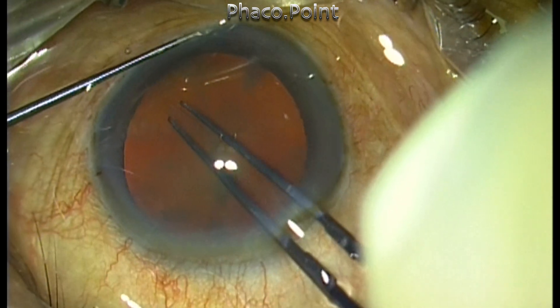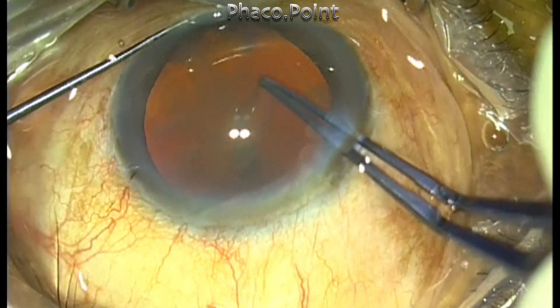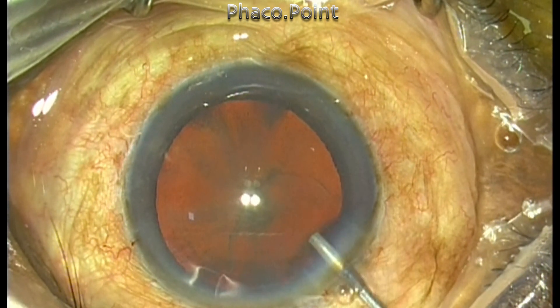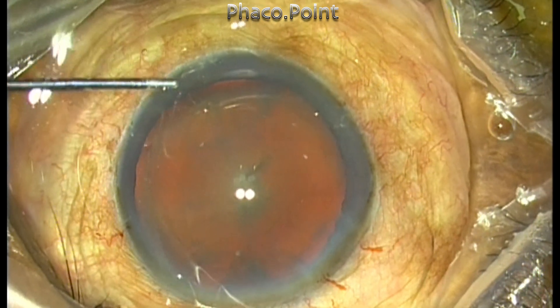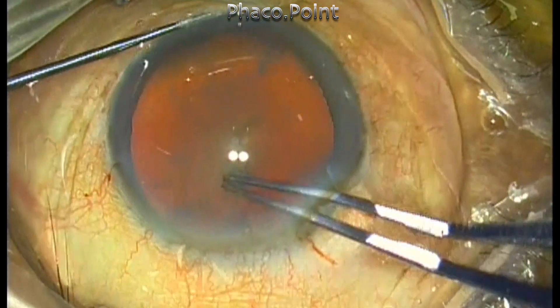The important thing while performing capsular rexes is that you get an adequately sized rexes. This should be slightly more than five and a half millimeters, because the nuclear substance is much larger — not only in the anterior-posterior depth but also in the equatorial diameter. Therefore the fragments you create will be very large, and mobilization will be easier with a larger capsular rexes.